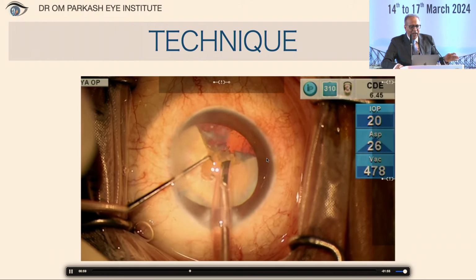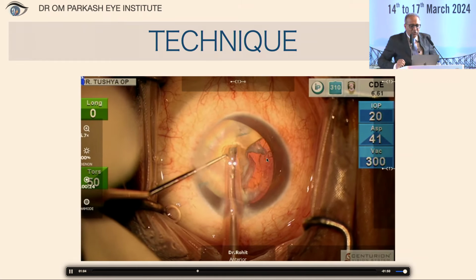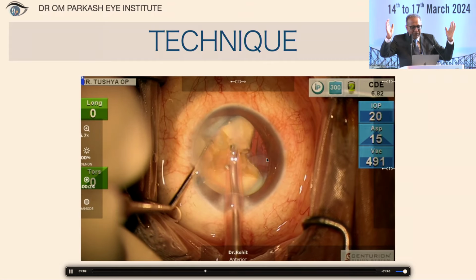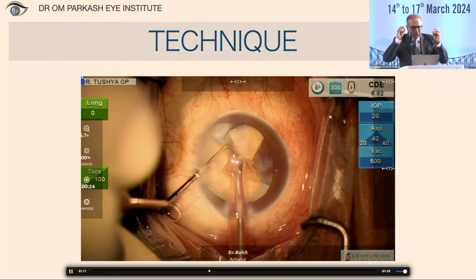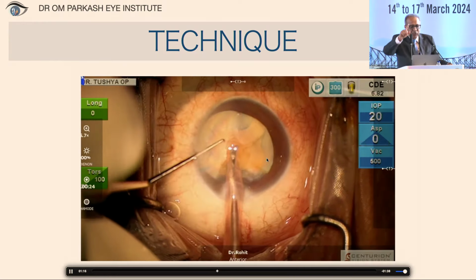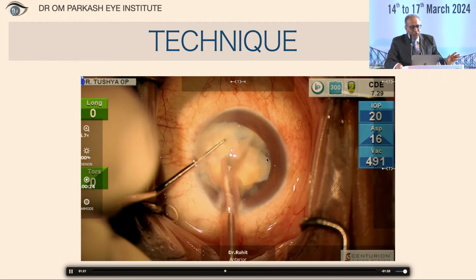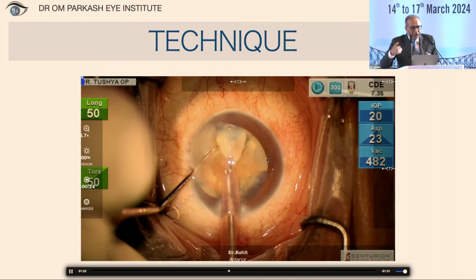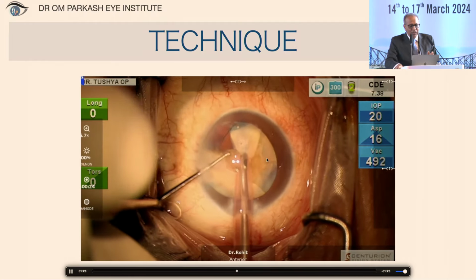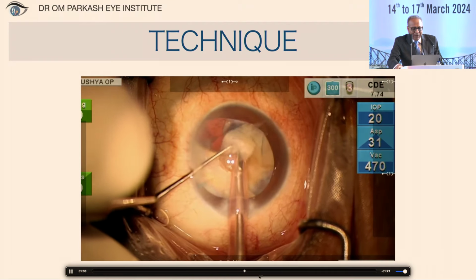And I'll show you how I will use the chopper as a shield. I'm continuing with it. Now what is happening with this? There is low infusion pressure. There is no posterior bulging of the posterior capsule. There is low infusion of fluid, and there is less stress to the end point of the flap. All this is happening, and by any means, if the fluid is going behind, that is not disturbing the anterior hyaloid phase. So this process is continuing, and you will find still that the flap is fluttering.